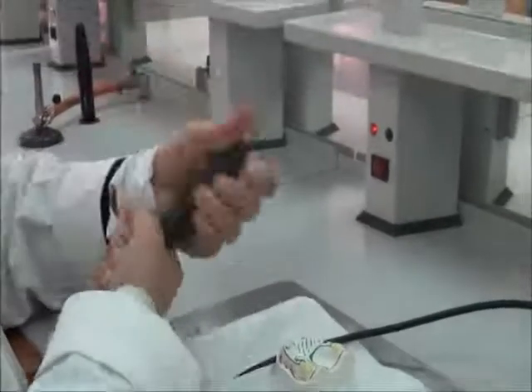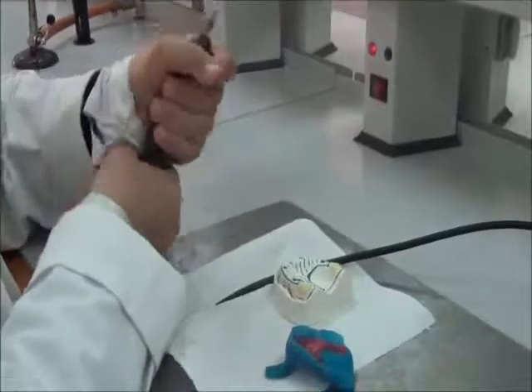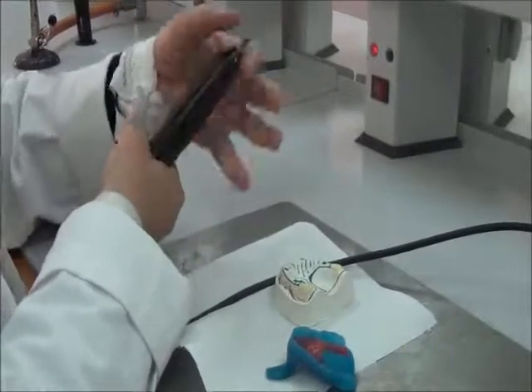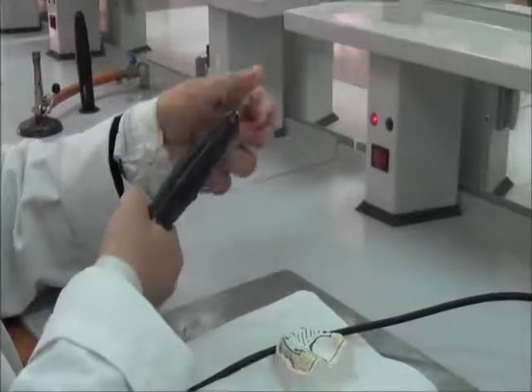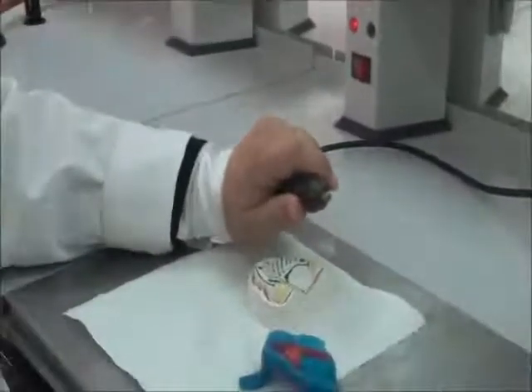To take the bur in and out, you need to rotate the handpiece, put your acrylic bur in, and then secure it. We need to make sure that burs are secure before working, because if they are not secure, they might come out and traumatize you.